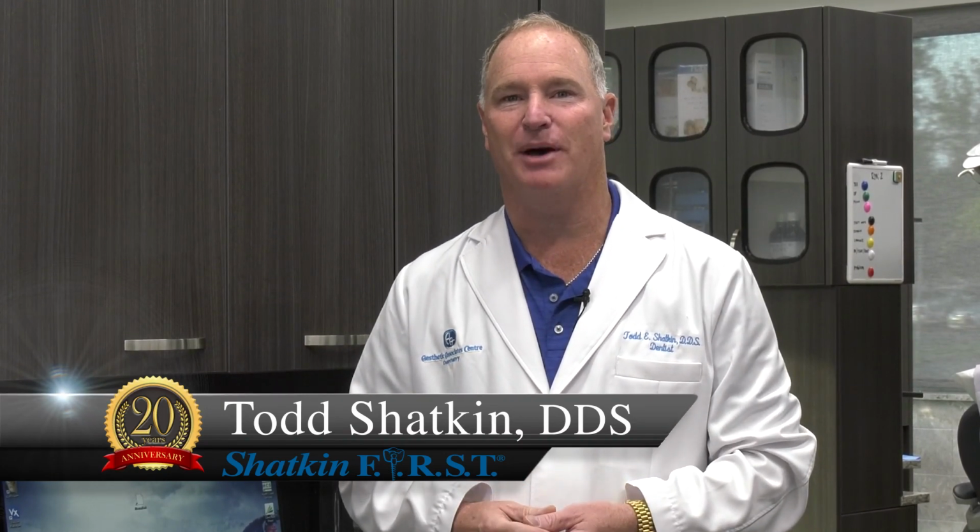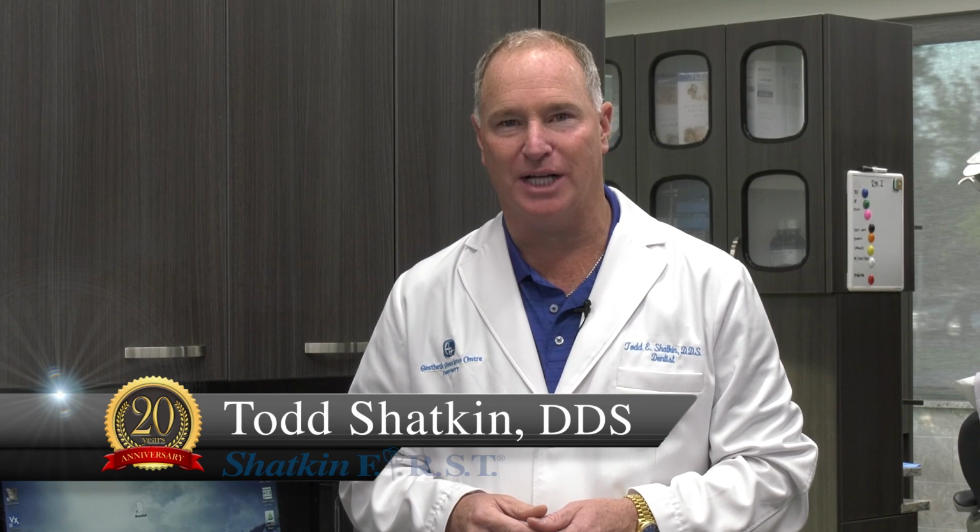Today I want to speak to you about the importance of using surgical guide stents and proper preoperative planning for your mini implant cases. It is paramount to have proper planning, and the only way to do that is to thoroughly review the x-rays, the models, and plan exactly where you want to place the implants. The very best way to do that is by using a surgical guide with a 3D surgical CBCT stent.